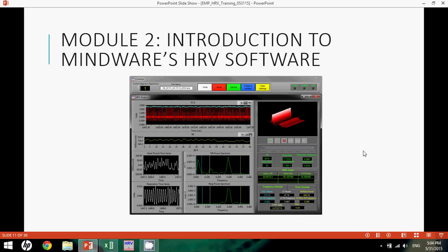I'm going to go ahead and start here with the second module. We're going to take a look at Mindware's HRV software. This program is quite intricate. There's a lot of options, so it's important not to get lost in the process of doing this.